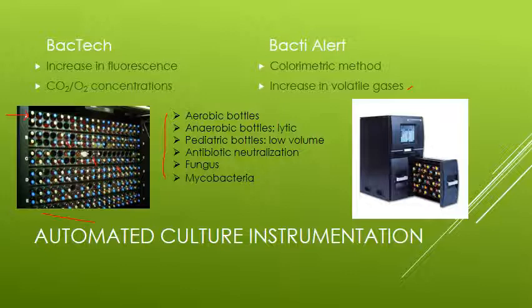And these help us to meet some of the JCO requirements that go with bottle handling. Also, they go with specimen collection procedures, contamination rates, and training people who aren't apparently cleaning the site properly. So those are things that allow us in the lab to meet those JCO standards across the entire hospital. So this might affect nurses. You know, if you find that Nurse Ratchet up in the ICU keeps contaminating the bottles, well, Nurse Ratchet needs retraining.